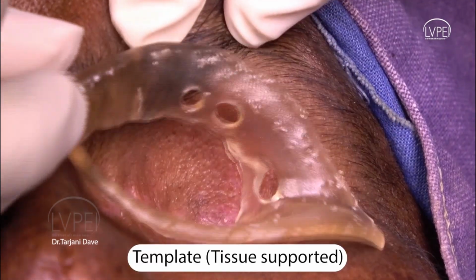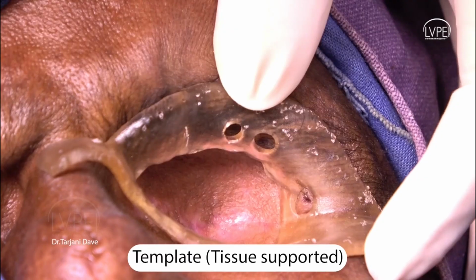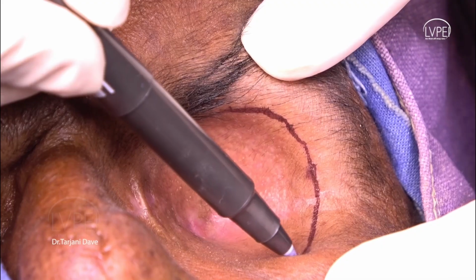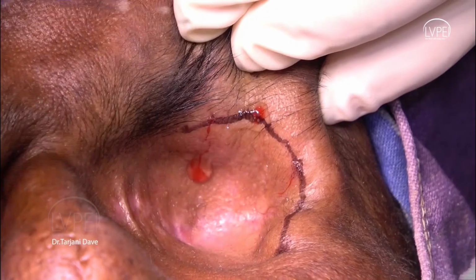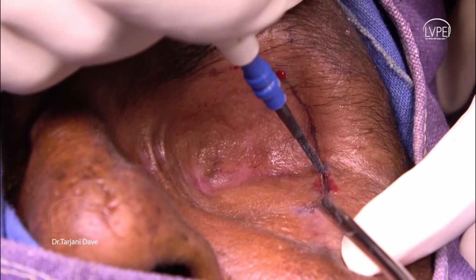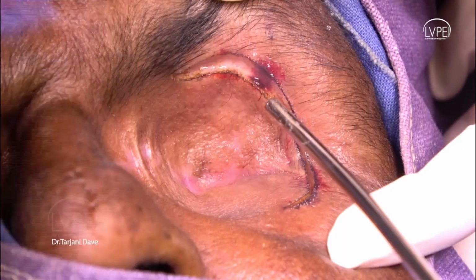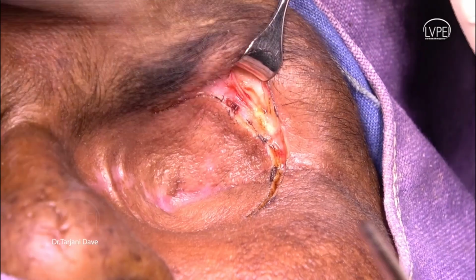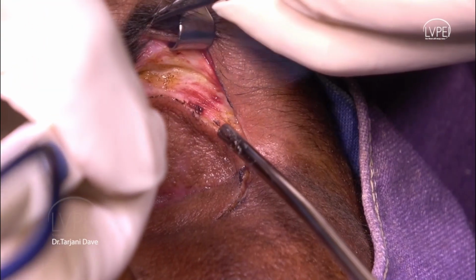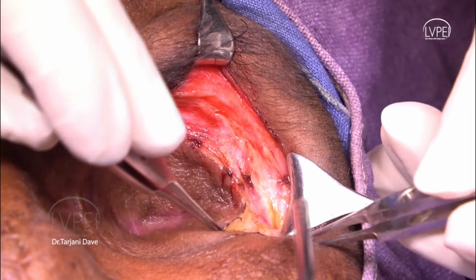Let us move on to the osseointegration step 1. With the help of a soft tissue template, the skin marking is made and joined together. Local anesthetic agent is infiltrated subcutaneously. Skin incision is made with a radiofrequency cautery. Progressively, the subcutaneous tissue, orbicularis oculi, and deeper tissues are incised with a radiofrequency cautery in order to reach the periosteum overlying the lateral orbital wall.